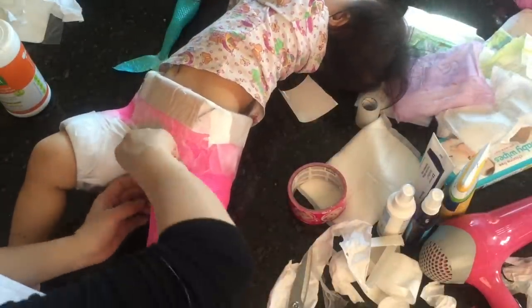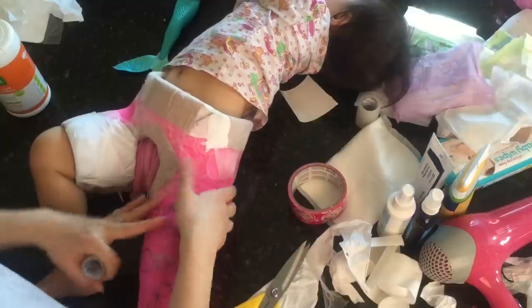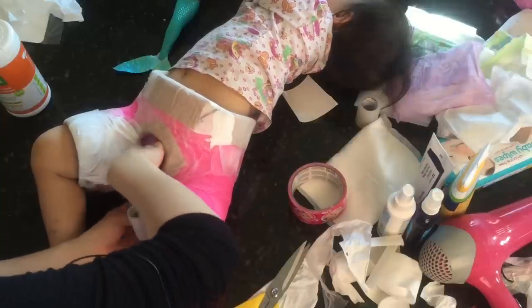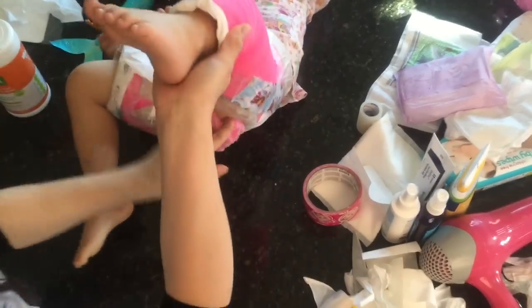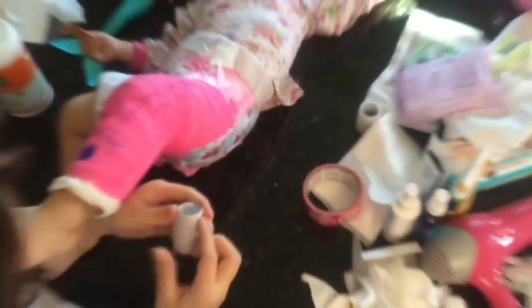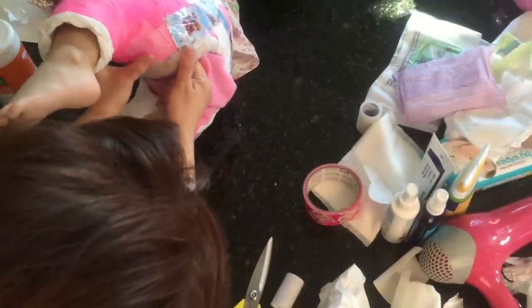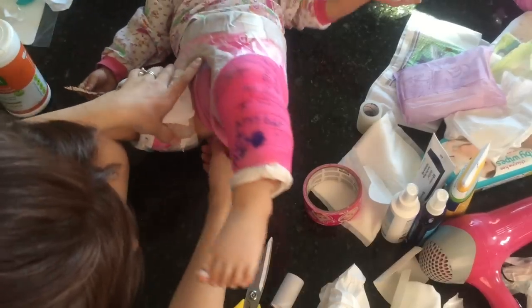Just imagine having this around you — it would be so uncomfortable. I try to make it as dry and comfortable as possible. At this point I don't smell any urine — just the new tape and band-aid smell. Now I'm done with all the sealing. It's all sealed up nicely with tape all the way through. Make sure you have no spaces between the tape — if you see a gap, go around it, because that's where water can get in and make the whole thing wet.